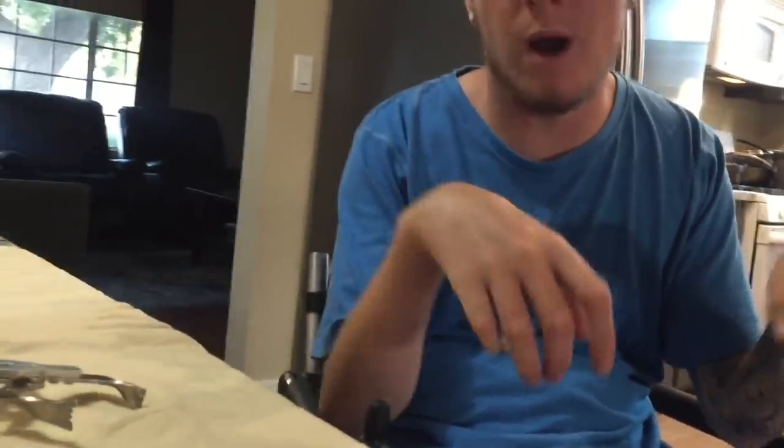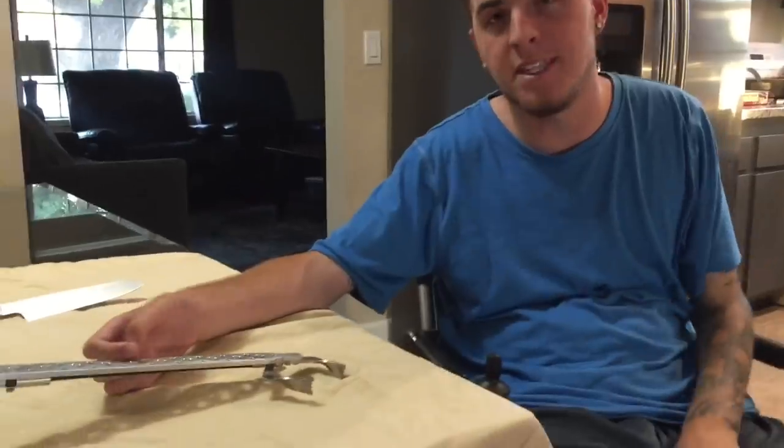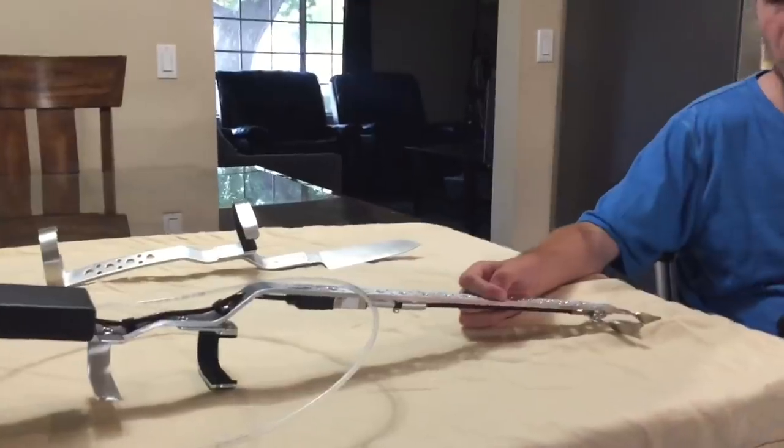I don't have any strength in my wrists or my fingers. It may look like I do when I move them around like this, but this is really just me moving my arms that makes my wrist move. If I just show you my wrist, it just sits like this. I'm not able to bend my wrists up, and if I let go they'll just fall back down. So I have no wrist or hand function, and that is the reason why I had to get the sip and puff with the motor on it.